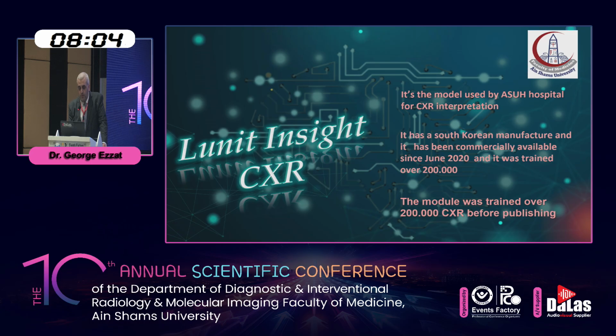In our study, we used Lunit Insight Chest X-ray software. It's a model used by the Ain Shams University hospitals for chest X-ray interpretation. It has a South Korean manufacturer, has been commercially available since June 2020, and was trained on over 200,000 cases.